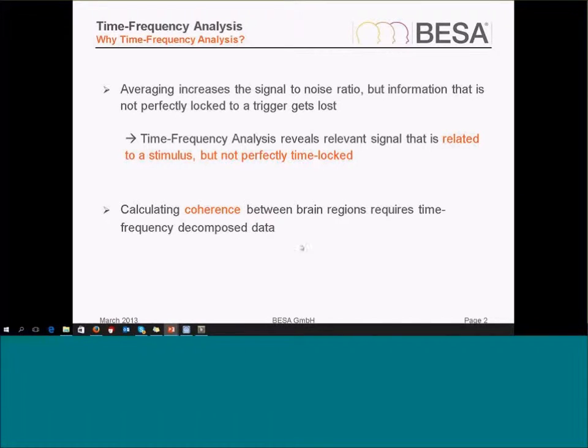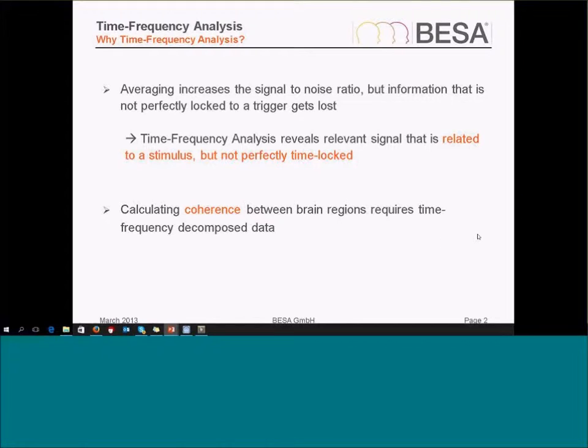Also, if I want to calculate coherence between brain regions, this requires a time-frequency data decomposition.